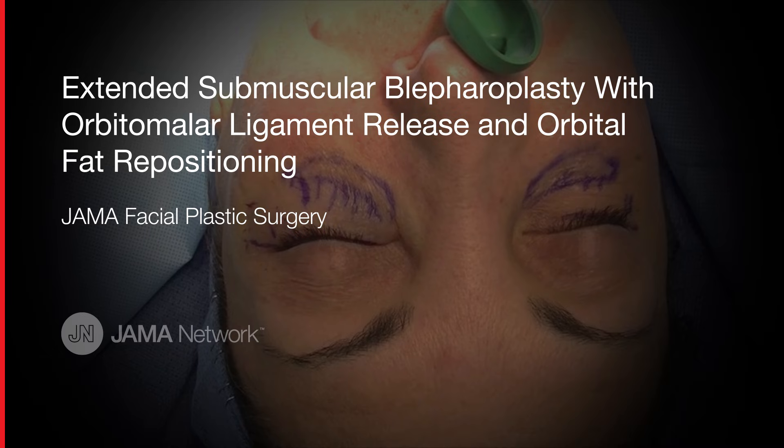This video will review my technique for extended blepharoplasty, orbital malar ligament release, and fat transposition.